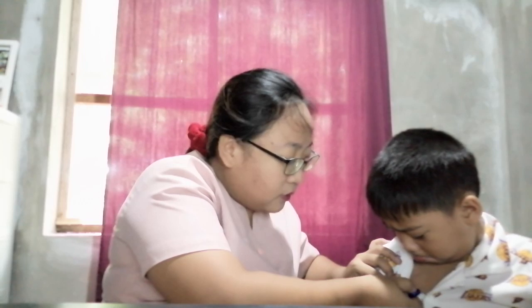You may hold the thermometer, especially if your client is very sick or weak and cannot hold the thermometer in his or her armpit. Be sure the thermometer is placed directly on the skin of the armpit. Leave the thermometer in place until it signals it is finished — you will hear the sound beep beep beep — and then you can remove the thermometer from the armpit.